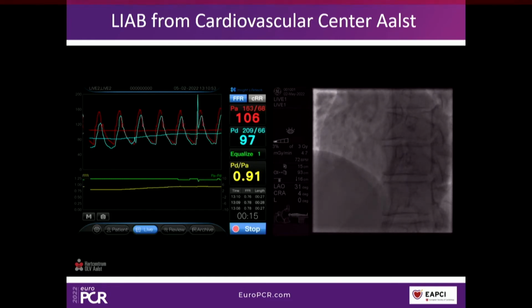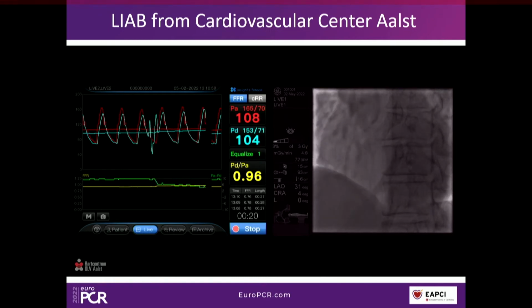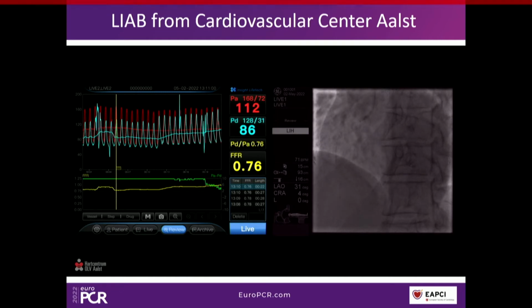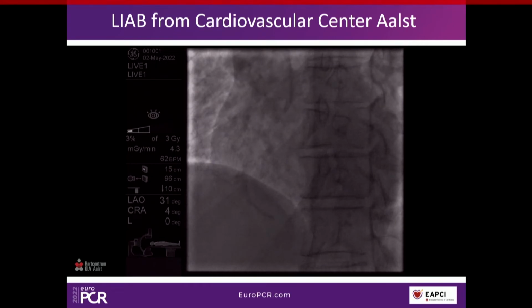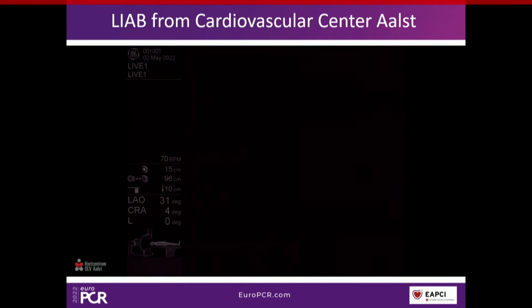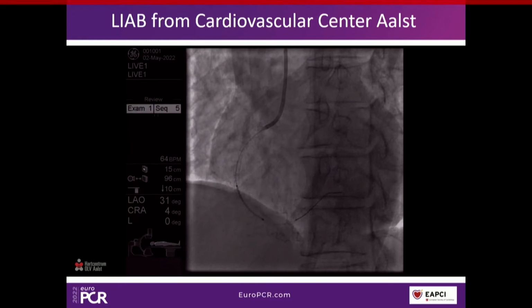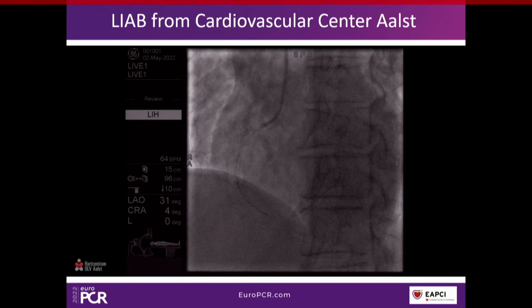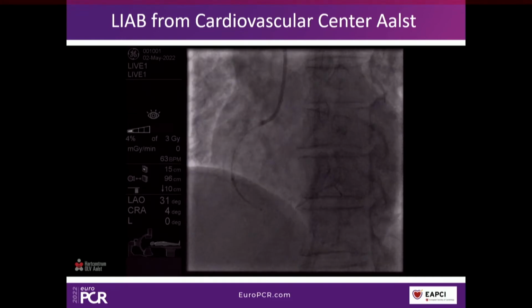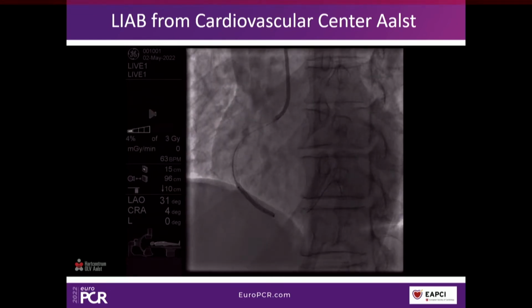There seems to be a step up just beyond the stent, huh? Stop. Yeah. Close first. It's quite good, huh? Yeah. Okay. 12 atmospheres.